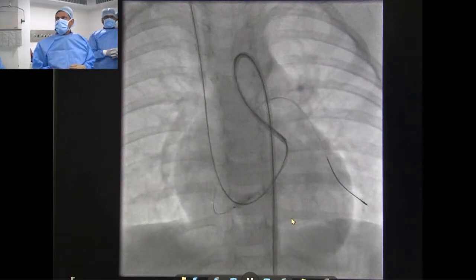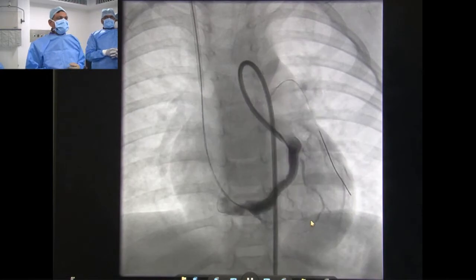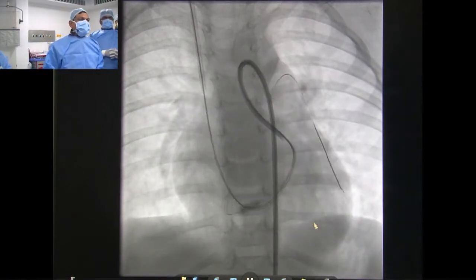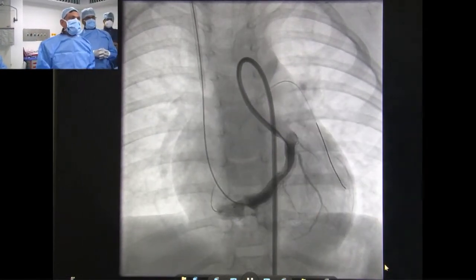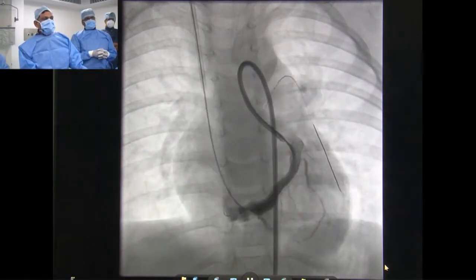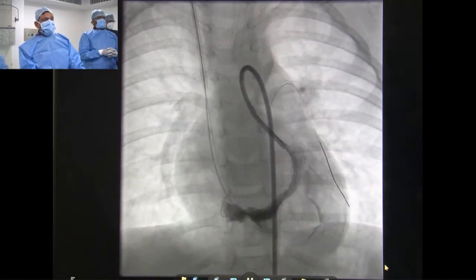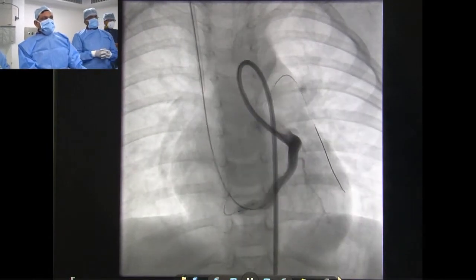Next angio, show the next angio. That is the balloon occlusion angio in AP view. You can see the left coronary LAD, and the circumflex is giving branches as distal as possible. The last OM 4 I can also see there, and that is the mouth there.